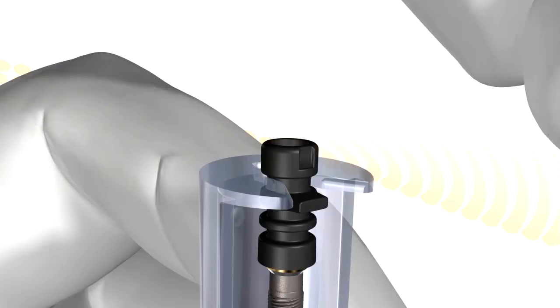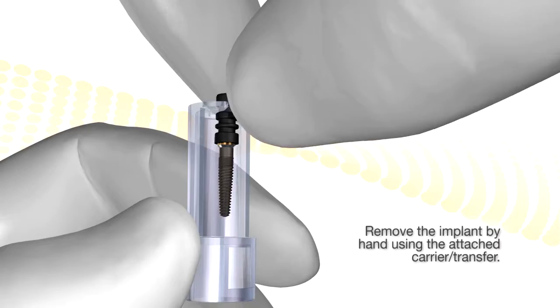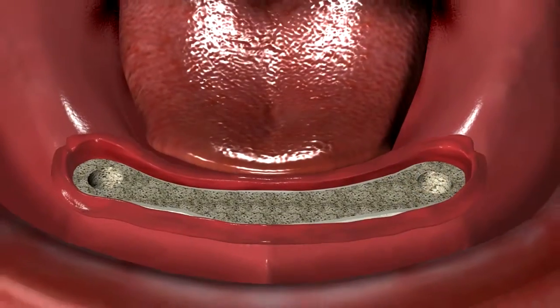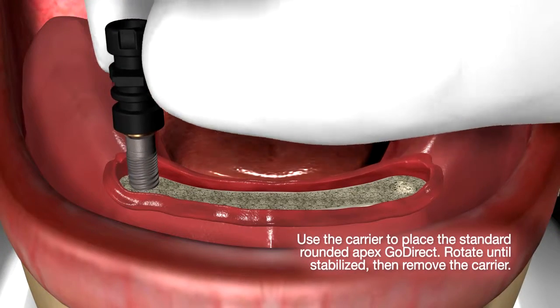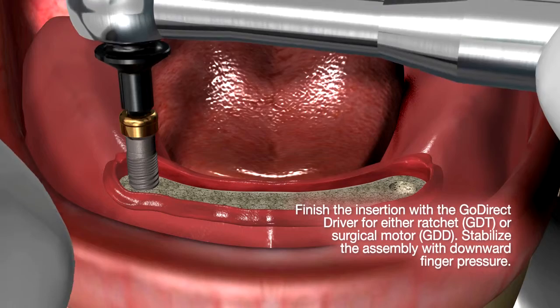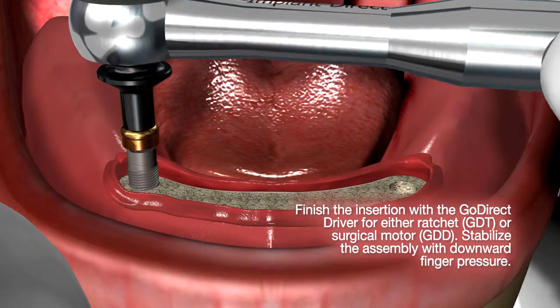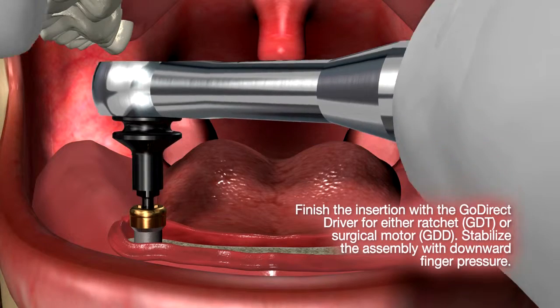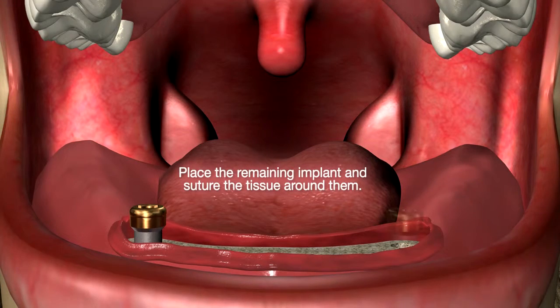So here is the GoDirect. It comes on a carrier that is a snap transfer. Just start its insertion, put the tool in and ratchet it to its appropriate depth. You have a 1.5mm collar, which is usually the thickness of the soft tissue. If you need to leave it sticking up a little bit more, you could.